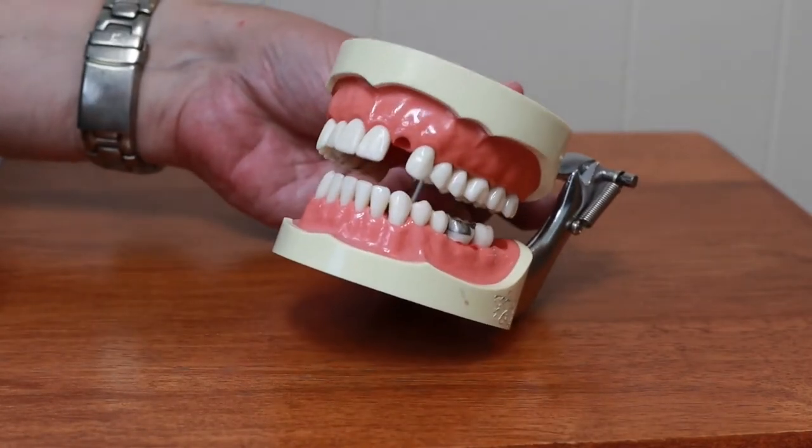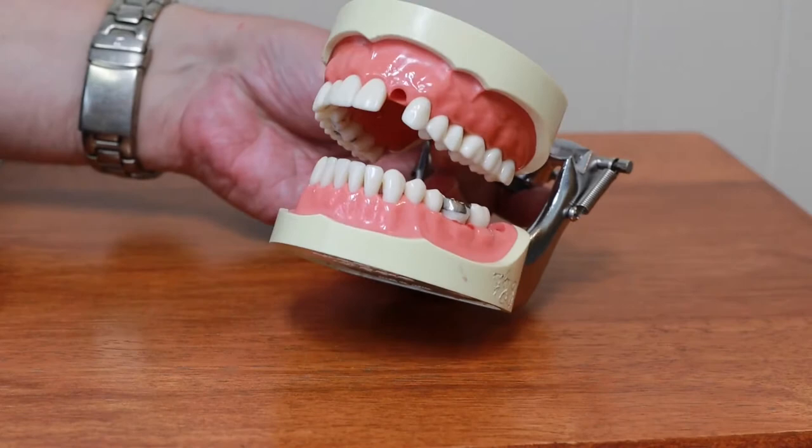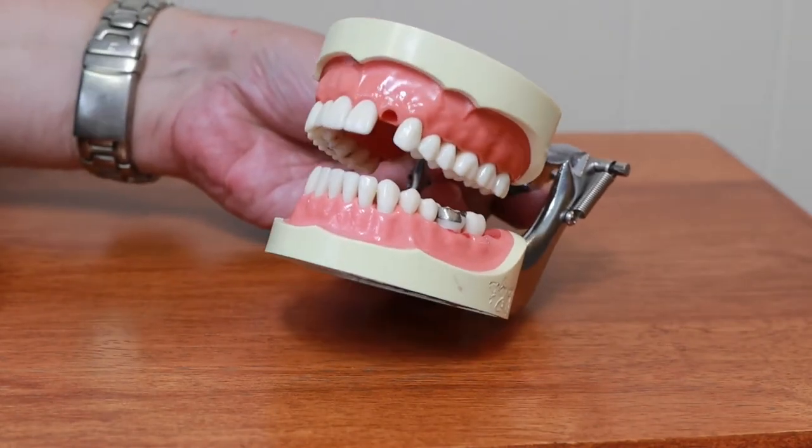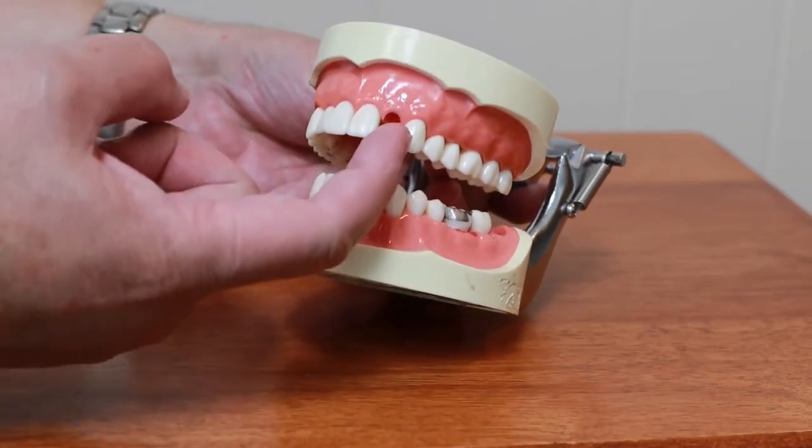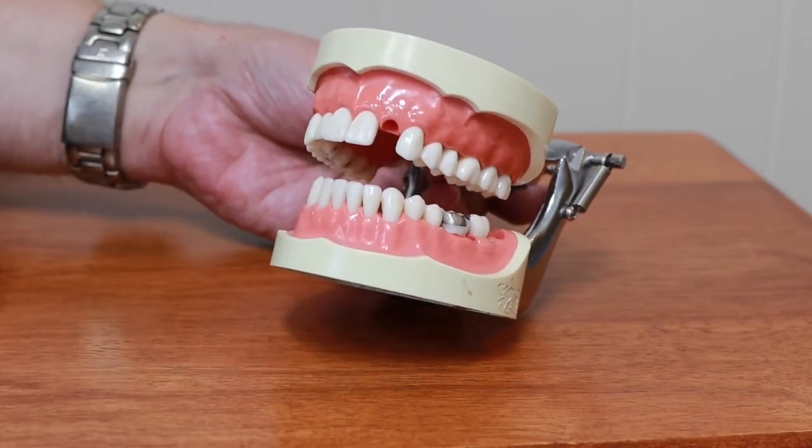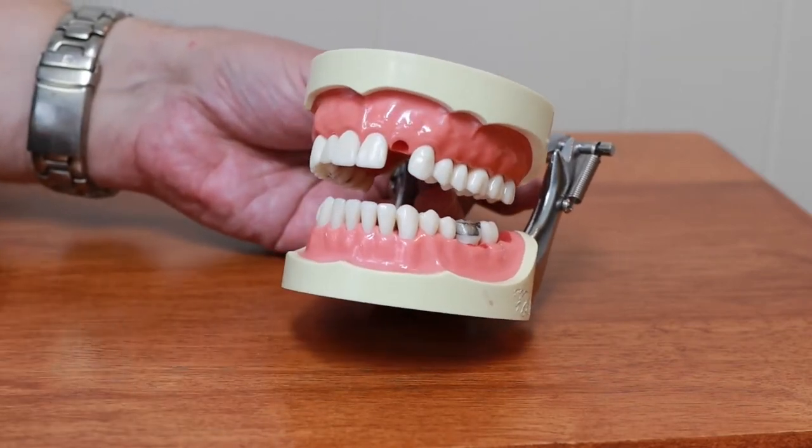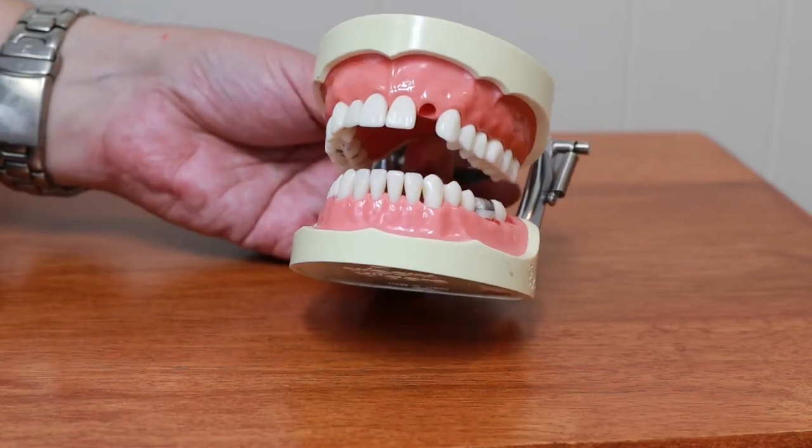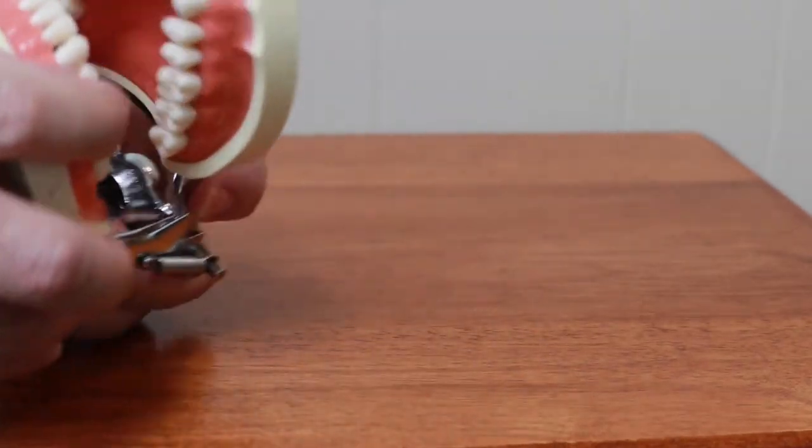This is the patient, call him Buster, an homage to Buster the crash test dummy on Mythbusters. I removed his upper left lateral incisor and this is what I'm going to use to make the Maryland bridge.